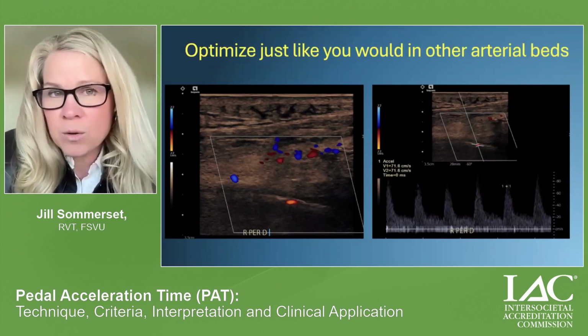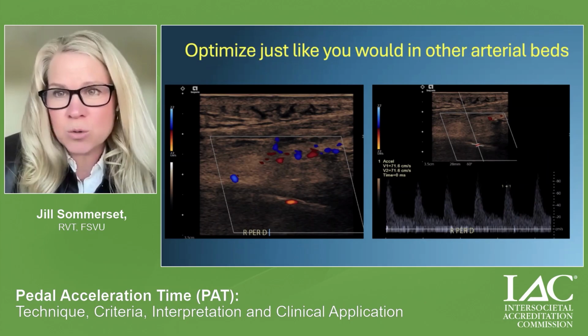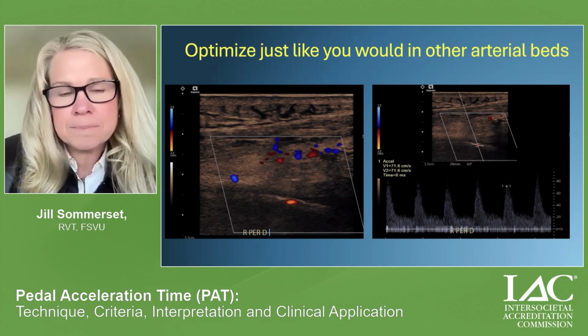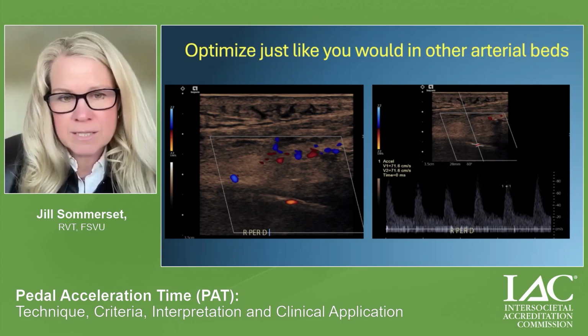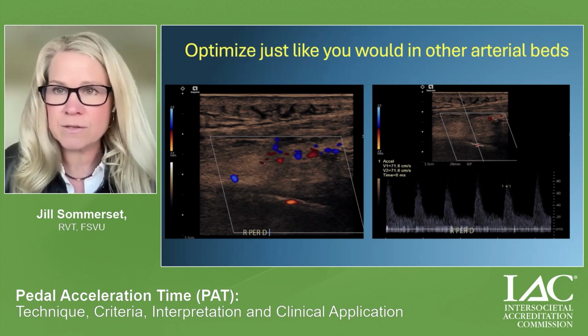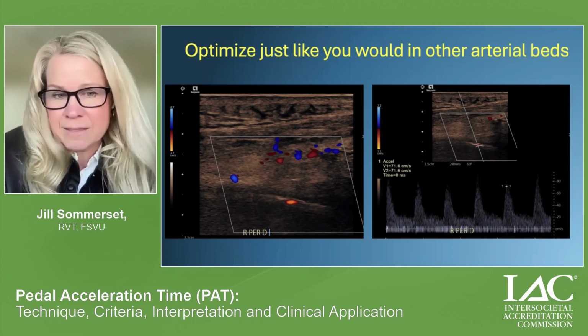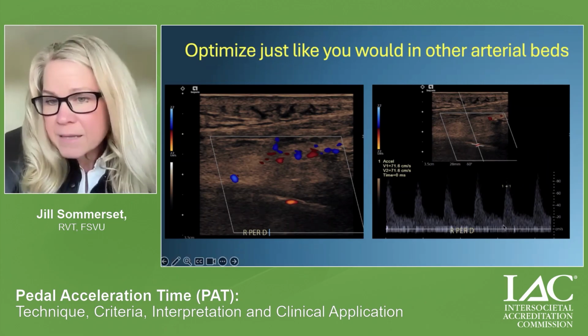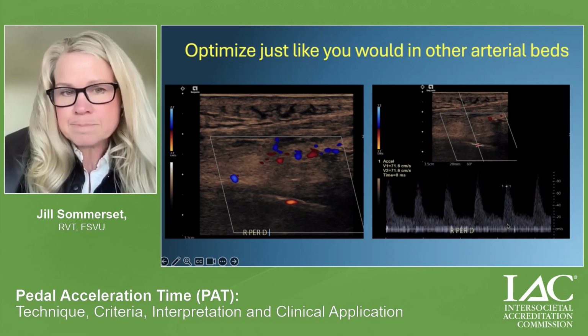Now, some may say all those examples are really beautiful, but what about real life scenarios? These patients are really hard. So my advice is to just optimize the image just as we would in any other bed of the body. The tibials can be very challenging to scan because they're calcified. Look at this peroneal, calcified vessel. We got a little color here, but the waveform isn't that bad.